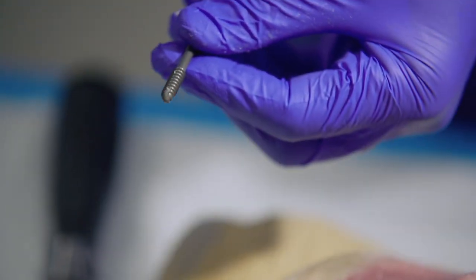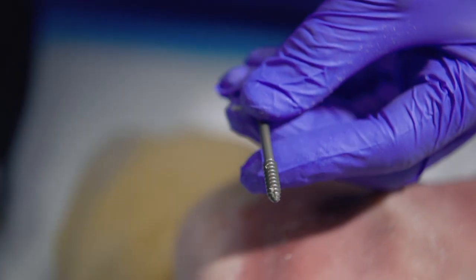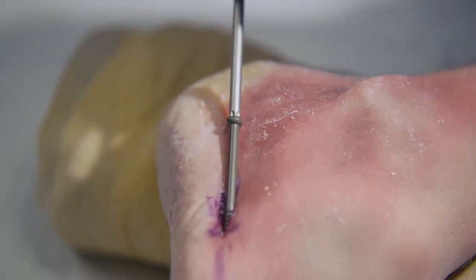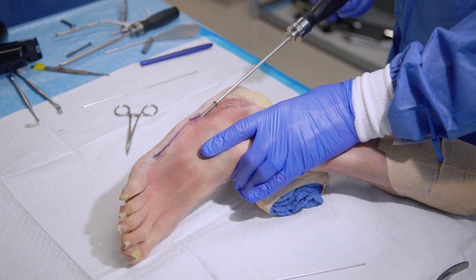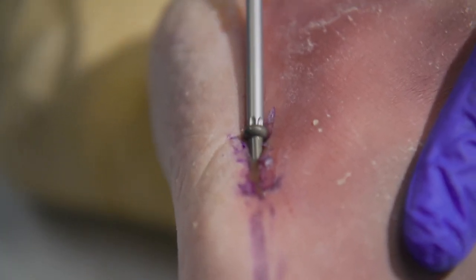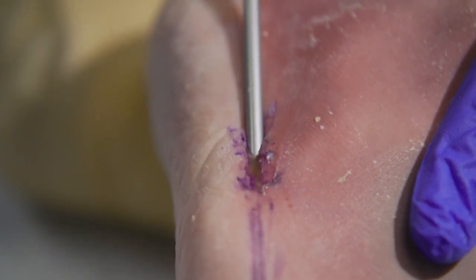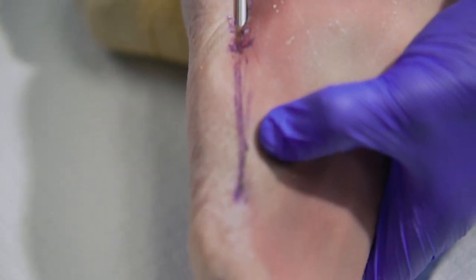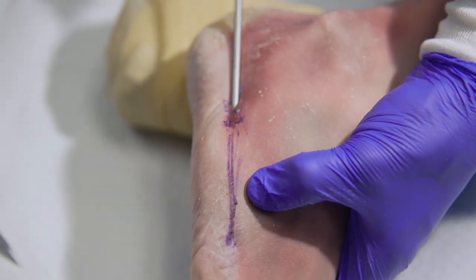So we will remove the guide wire. You should feel the threads of the screw grab the distal fragment of the fifth metatarsal. And as it engages the medullary canal, you'll feel a torquing of the entire metatarsal.